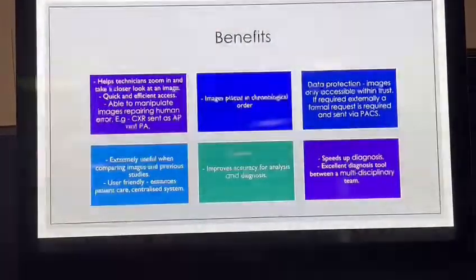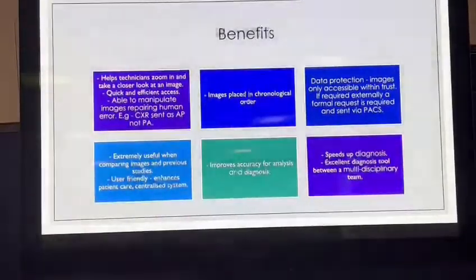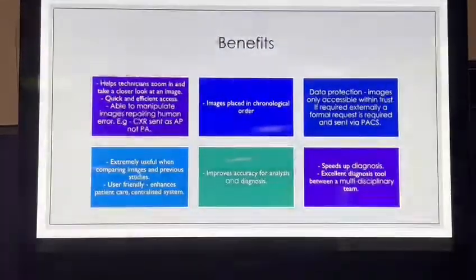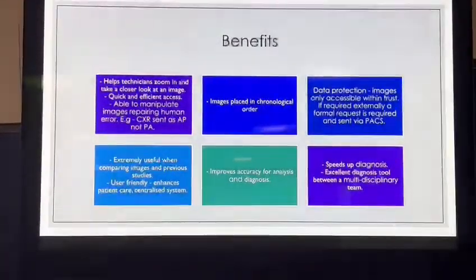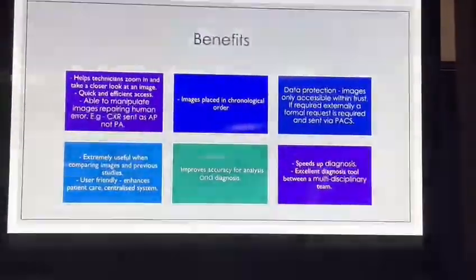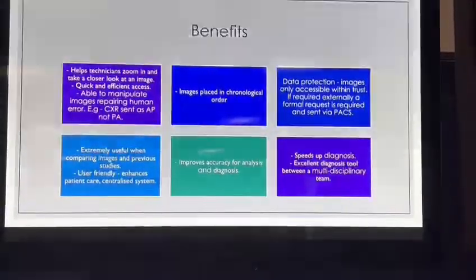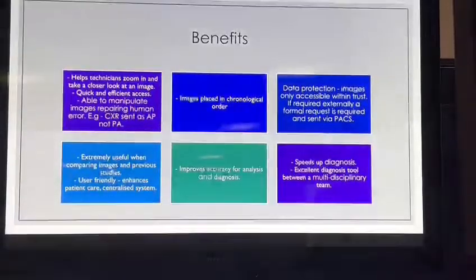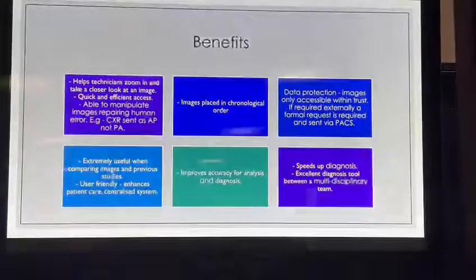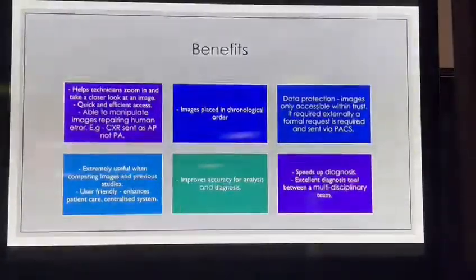Data protection: they're all accessible within the trust, but if you are trying to access the images from a different trust, it has to be requested first. It's extremely useful when you're comparing images in previous studies. It's user-friendly and enhances patient care, and it's a centralised system as well. It improves accuracy for analysis and diagnosis, and it speeds up diagnosis as well.